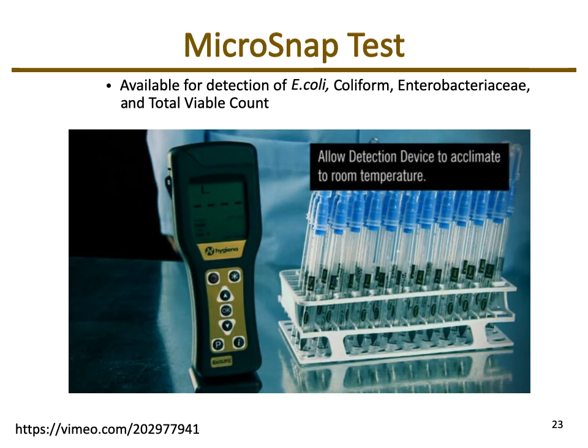Basically you have a swab that you swab the material with. You then take that swab and put it into some enrichment material, so a second tube. I believe those blue caps are the enrichment tubes. And then after a short incubation time, those tubes are put into that machine and read to determine whether there are any microbes detected.